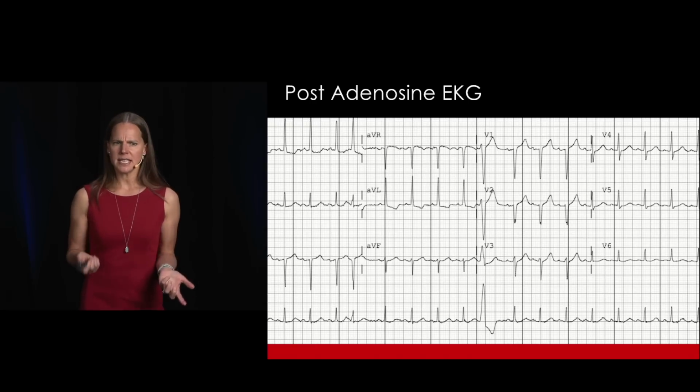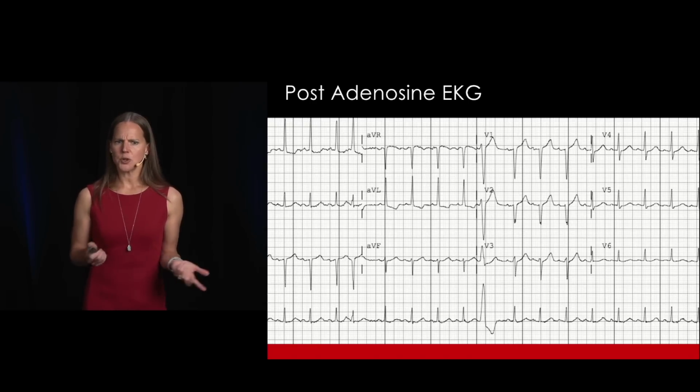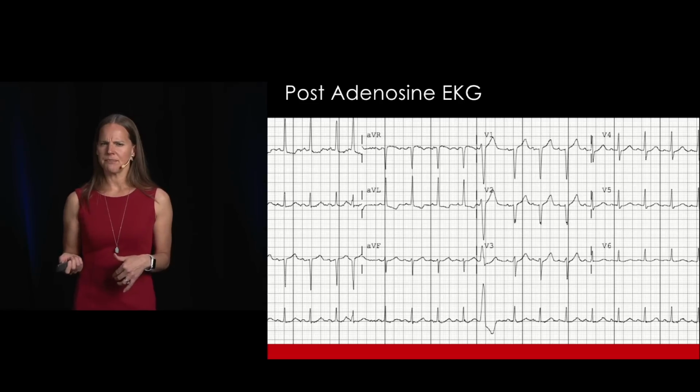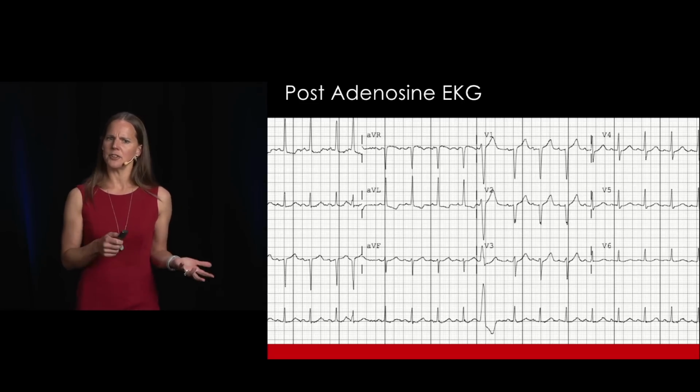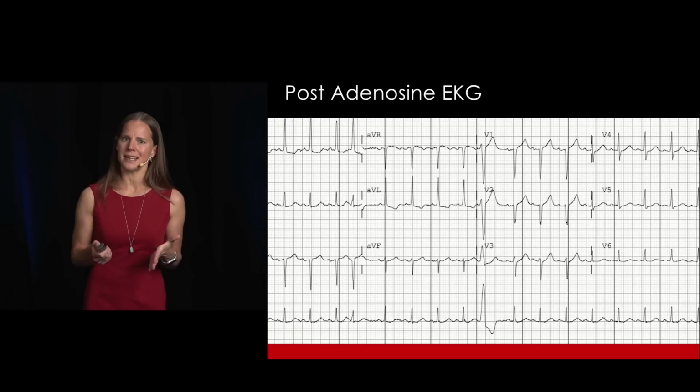And now you see this ECG. And it's quite different. He's now in a sinus rhythm. And again, the patient had a few risk factors, and this is a different looking ECG. It's more narrow complex.